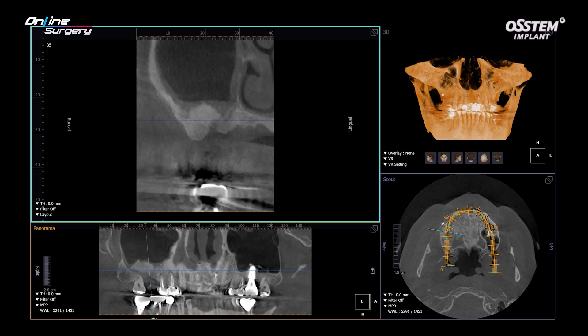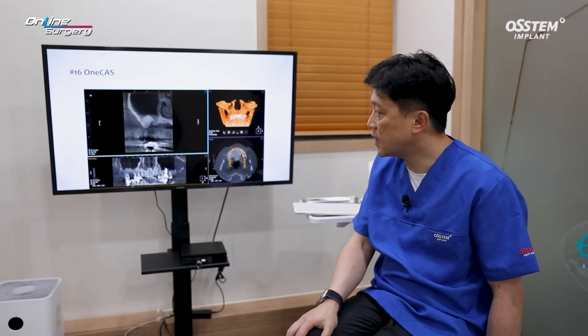On CT, there is not a satisfactory amount of vertical bone regeneration. On the palatal side, there is a slight bone defect.